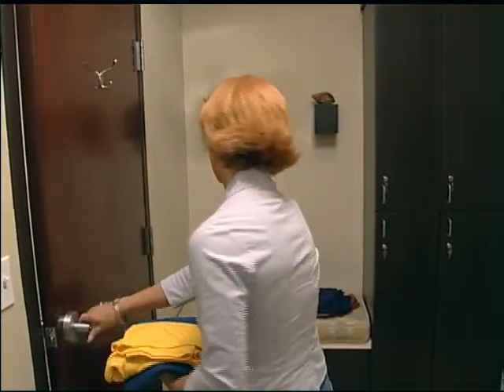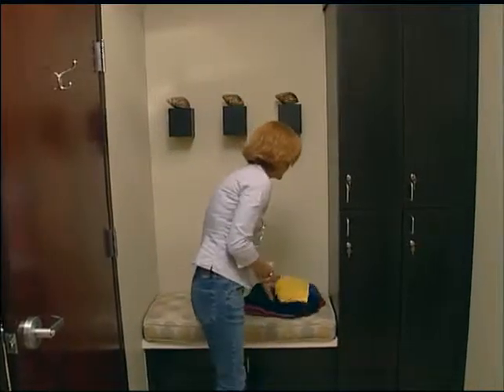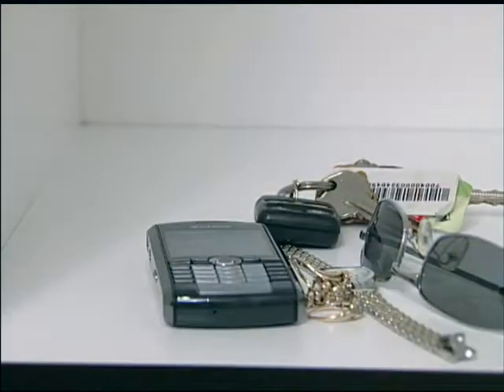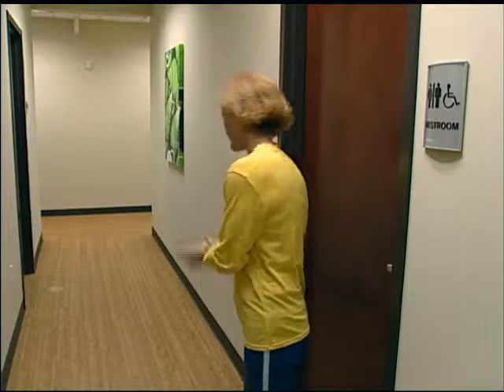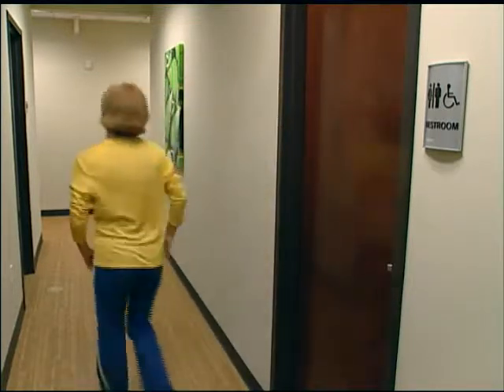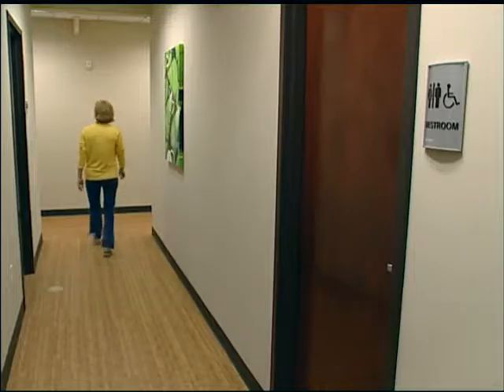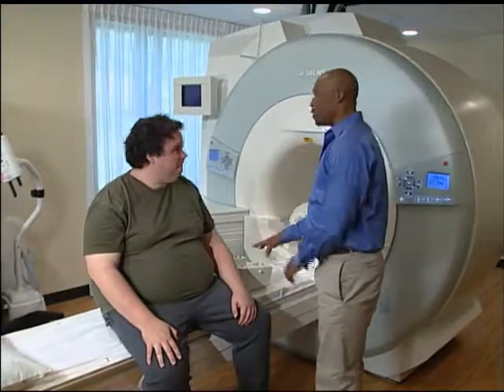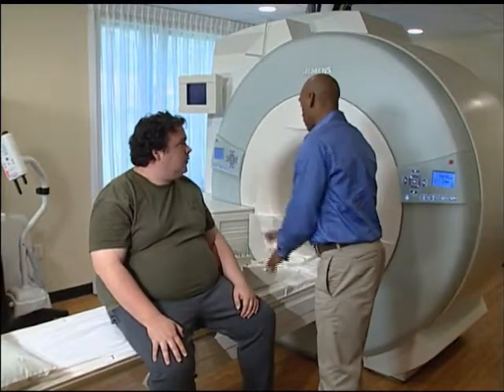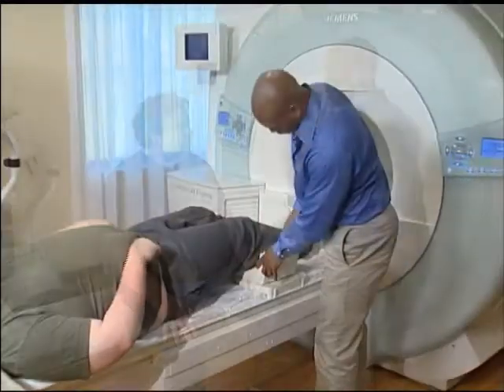Objects containing ferrous metals will also interfere with obtaining a good MR image. Therefore, it's advisable to wear a sweatsuit, clothes without zippers, snaps, or buckles, or garments provided by the imaging facility. To improve the image quality, particularly when examining the head, knee, or spine, a device called a coil is used. It operates just like an antenna to improve the signal reception.